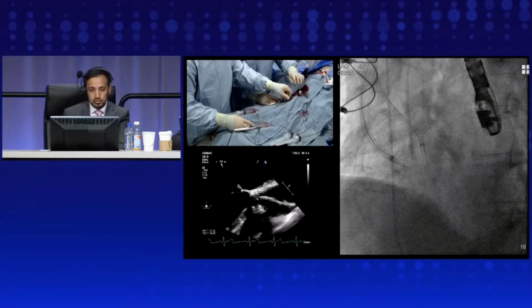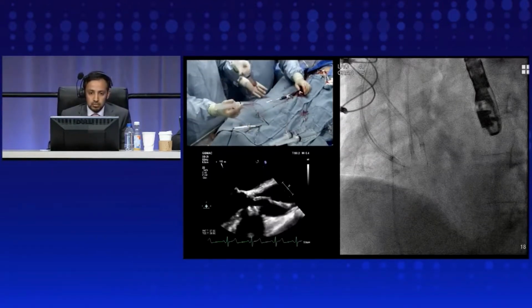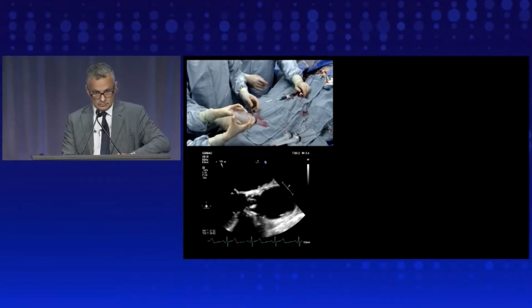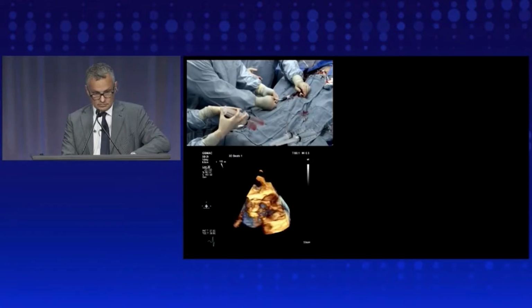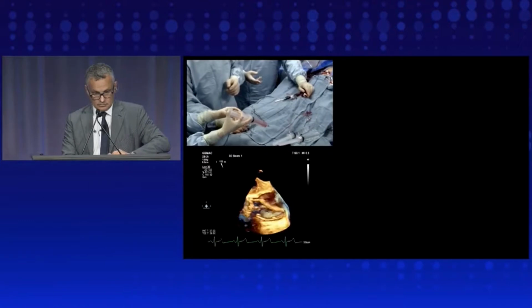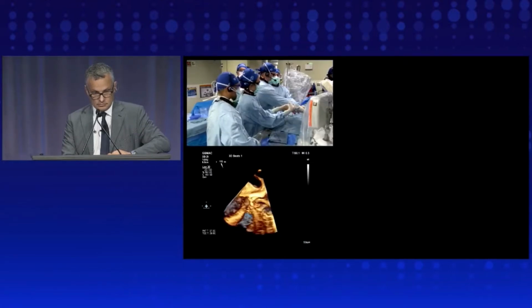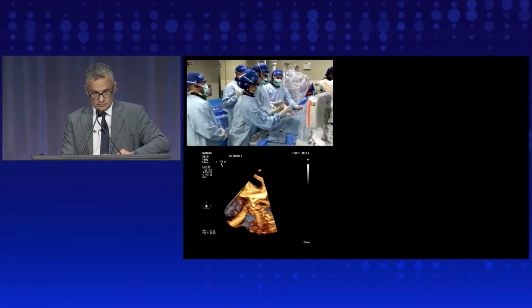No, it's a great question. Generally, the majority of the bioprosthetic valves, it really is a very easy pull. In many aspects, they differ. Porcine leaflets are more gentle. They tend to tear occasionally in an abnormal manner. They require less energy to cross and to lacerate commonly. And it sometimes depends whether it's a stentless porcine or it's a mosaic or epic. Each valve really has its own characteristics.